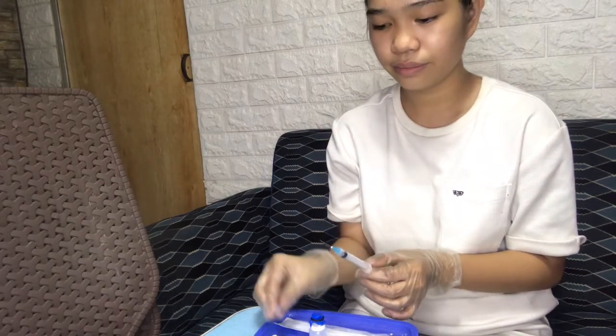So attach a filter needle as agency practice dictates to draw up premixed liquid medications from multi-dose vials. Ensure that the needle is firmly attached to the syringe, so there will be no injury or accidents that might happen here. Next is remove the cap from the needle. Then draw up into the syringe the amount of air equal to the volume of the medication.